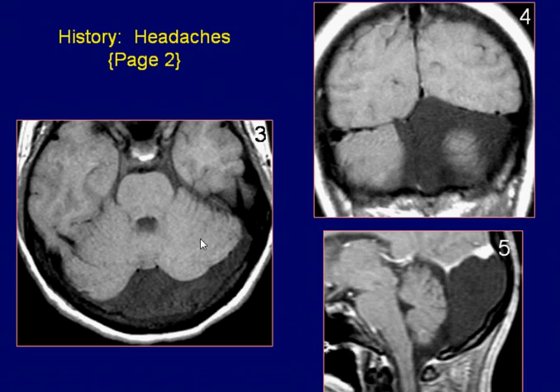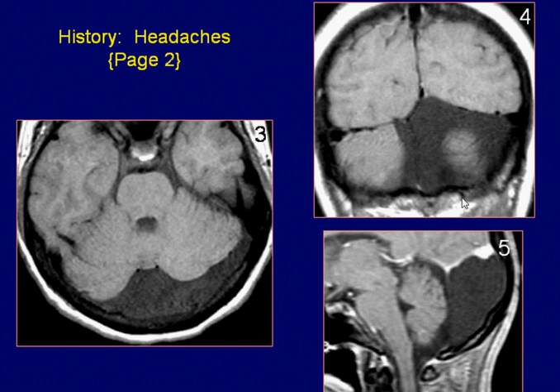Axial T1-weighted image shows a low signal lesion causing mild mass effect on the adjacent cerebellum. Coronal T1-weighted image shows the lesion is located underneath the tentorium on the left side of the posterior fossa.